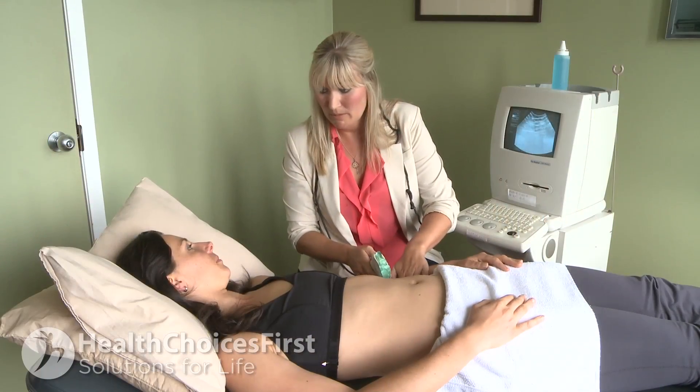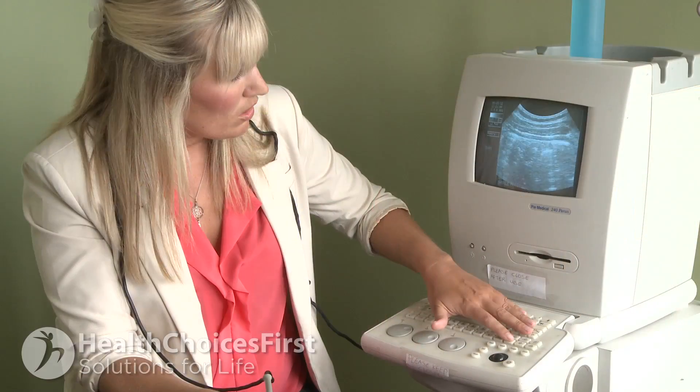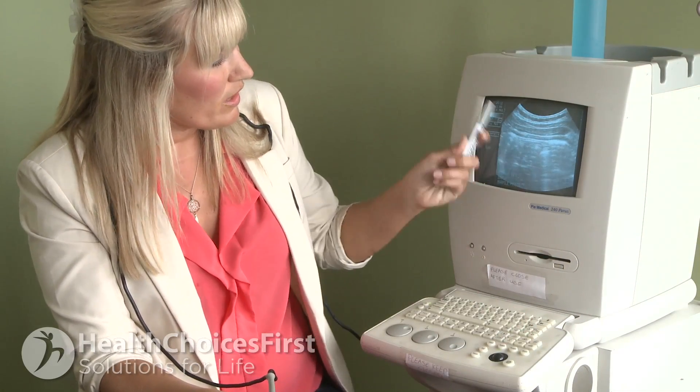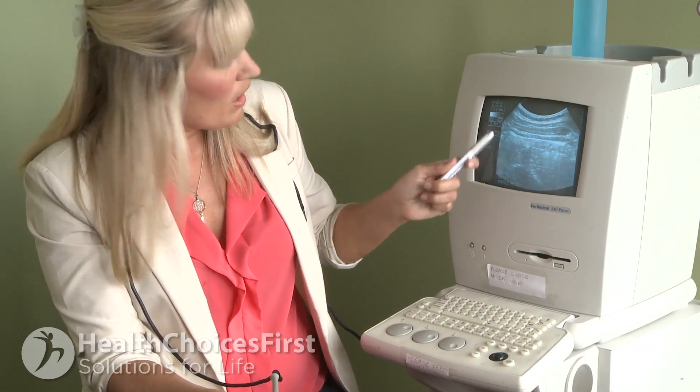Rehabilitative ultrasound imaging is a relatively new and advanced method that physiotherapists are using to image the whole abdominal system. With the real-time ultrasound, the physiotherapist is able to pick out precisely where the dysfunction is in the muscle by viewing it on the screen in real time.